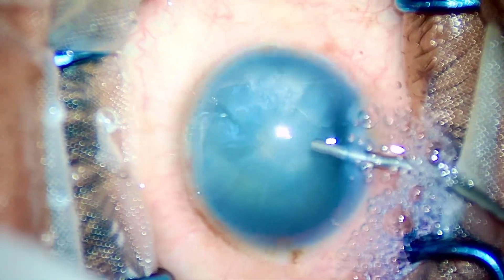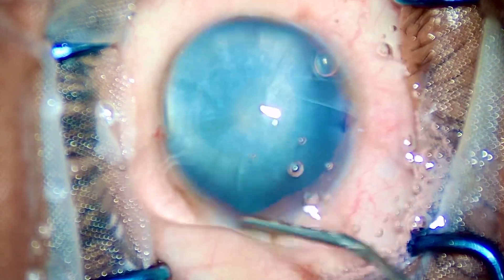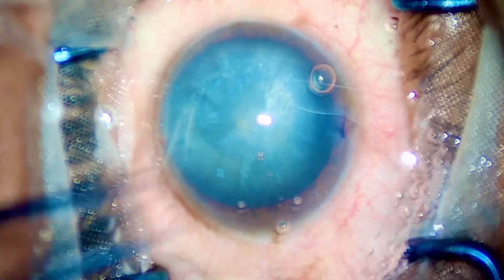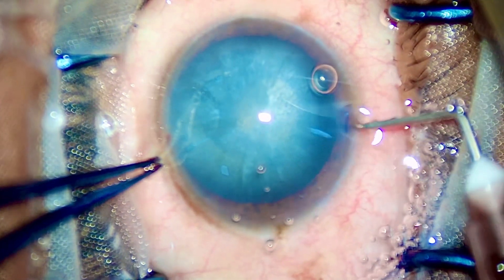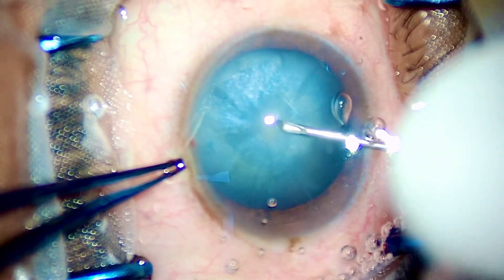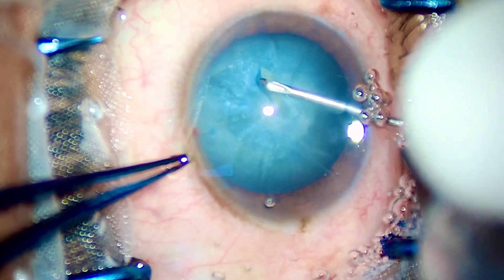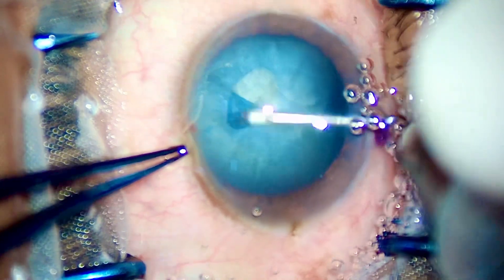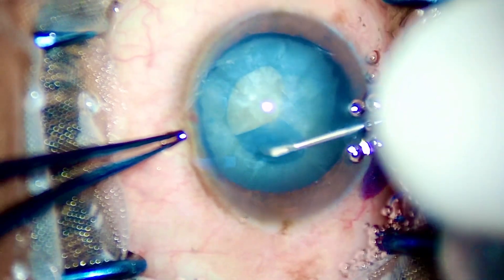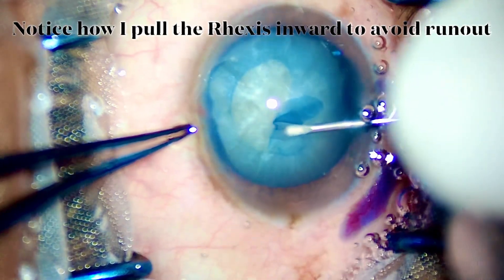We as learners, we as ophthalmic surgeons, must try to reproduce the results that FLAX offers — that is the best possible incisions, the best possible capsular rhexis, and brilliant vertical chops. These three steps are the ones that FLAX masters, and if you can reproduce these three steps in a beautiful fashion, you are a surgeon as good as a femto laser.